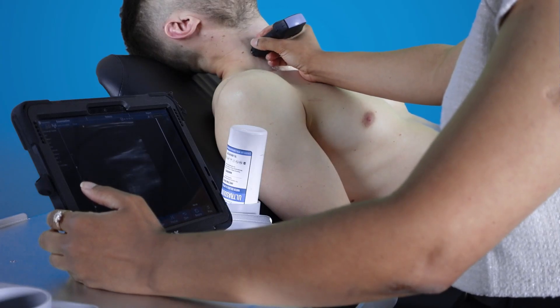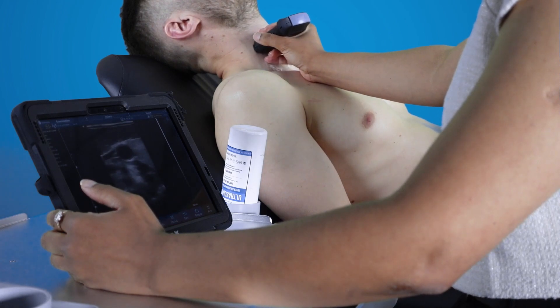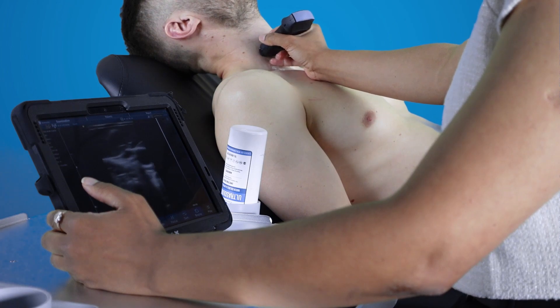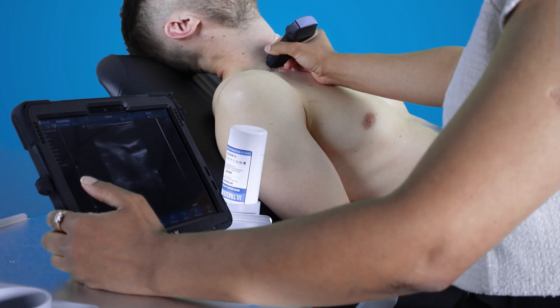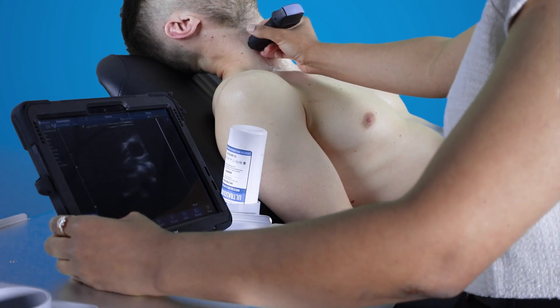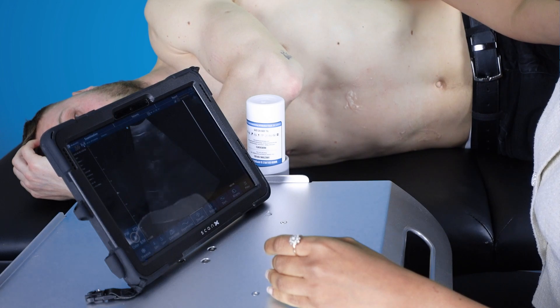We've scanned a neck — it's an excellent device to scan thyroids. The image quality is great and it's diagnostic. You can easily adjust the gain and depth, and you can also use vascular features such as colour doppler and power doppler.